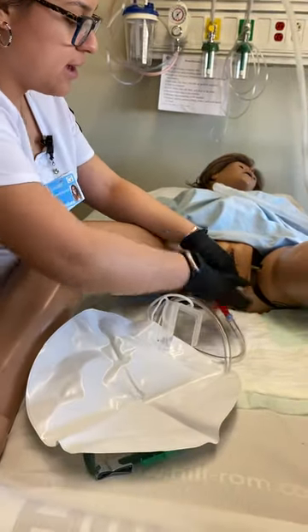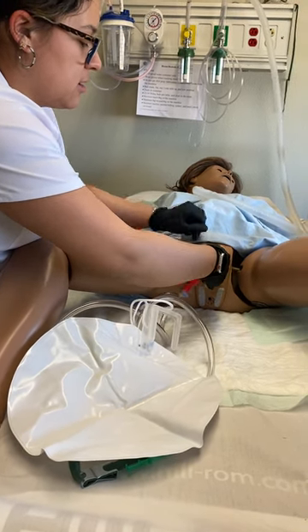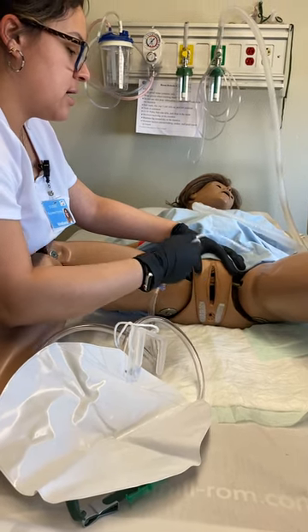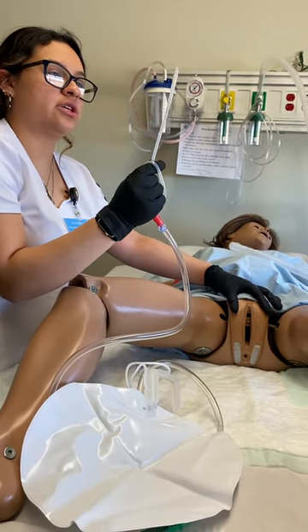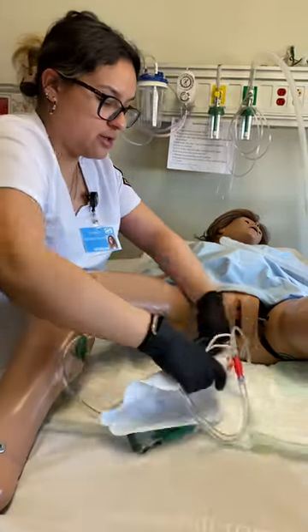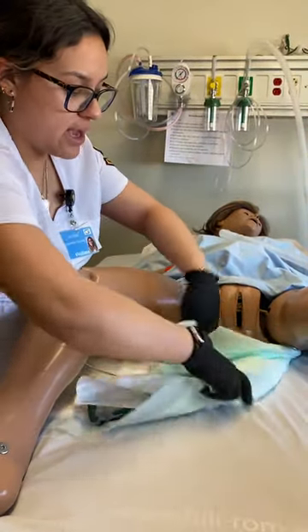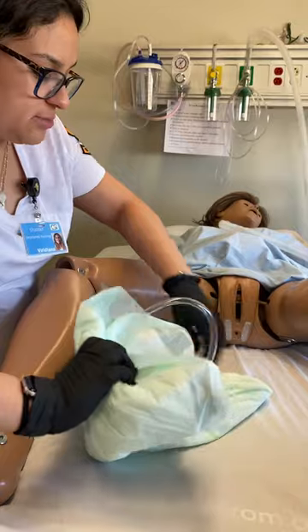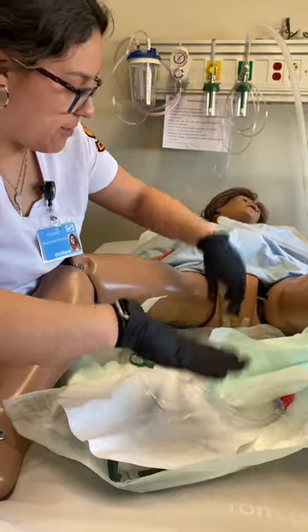Alrighty, I'm going to gather everything. Mrs. Smith, I'm going to ask you to just breathe out slowly while I remove the catheter. One, two, three. Alrighty, you're doing great. I'm making sure that I inspect the tip of the catheter — it is still intact, nothing is missing, and the balloon is completely deflated. I'm going to go ahead and wrap this underneath the chucks. Ideally the bag would be empty before removing the Foley. It looks like I have a little bit of seepage, so I'm going to take care of that before I wrap everything up.